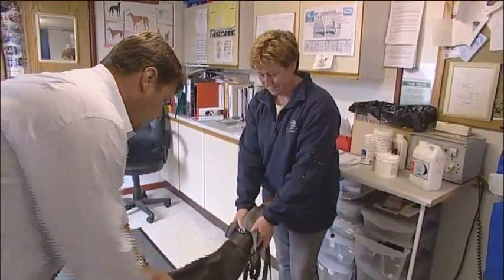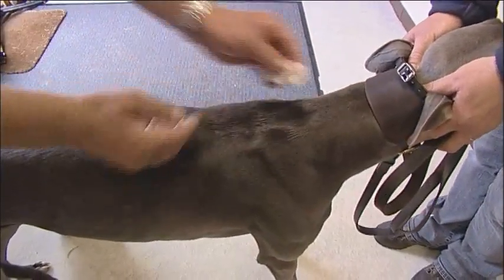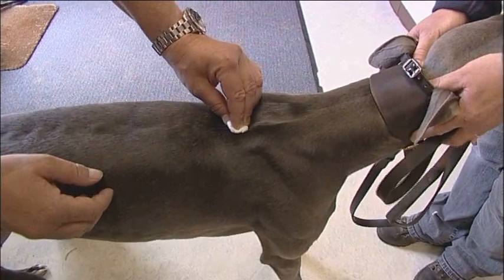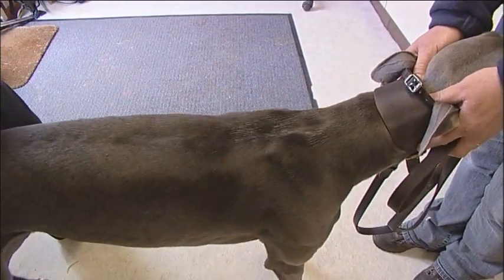Make sure the site between the shoulder blades where the chip is going to be inserted is sterilised. To do this, use a cotton swab with surgical spirit and wipe the area once or twice to remove any surface dirt.